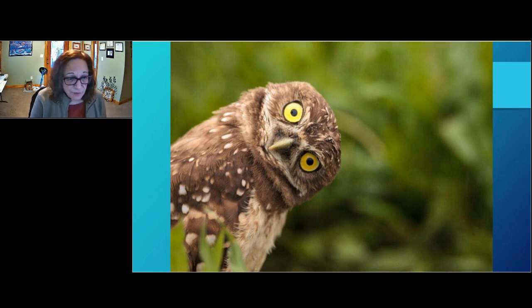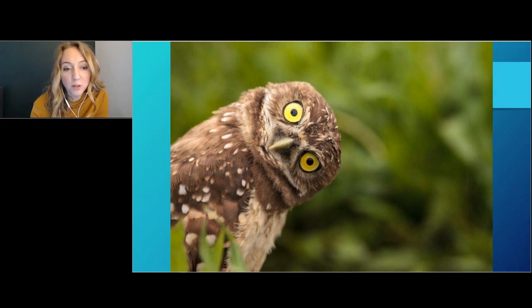So does anybody have any questions for me? All right. We actually have a lot of great questions that came through, so I will get started. First and foremost, we got a comment saying ST79 really drives home your point about do not crush, bend, compress, or puncture. So that's a standard that certainly speaks to the points you made about the rubber bands around the bins, closing them in a drawer, etc.